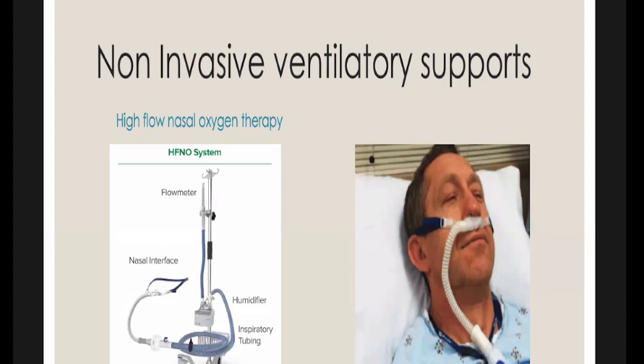Exactly. When the nasal cannulas are there and the high flow is going up, the patient should be able to keep his mouth closed. Otherwise, the effect is lost. The air can leak through the mouth, and the expected fraction of inspired oxygen will not reach the lungs. So this is not a good one if the patient is predominantly a mouth breather. It is not an effective method of ventilatory support.